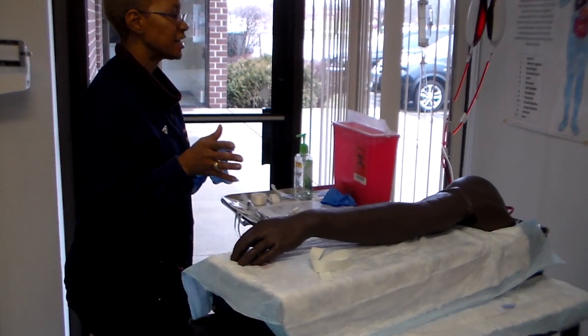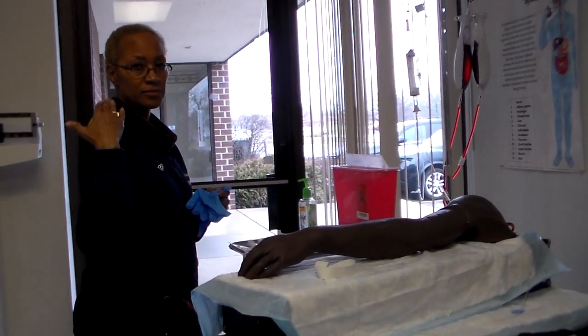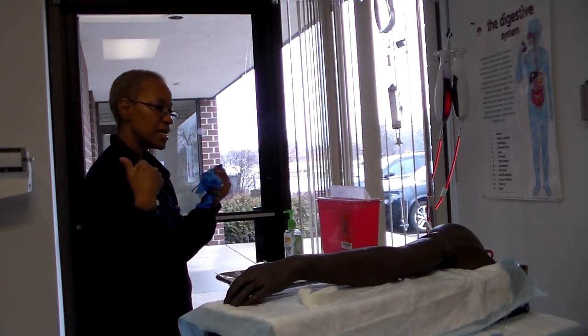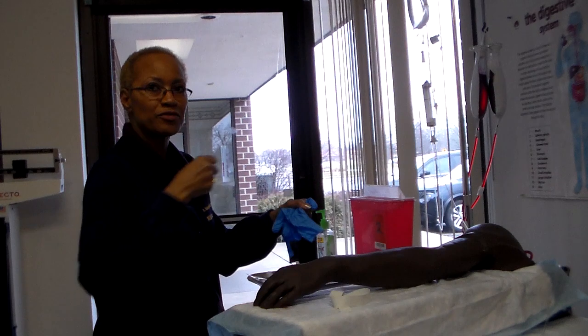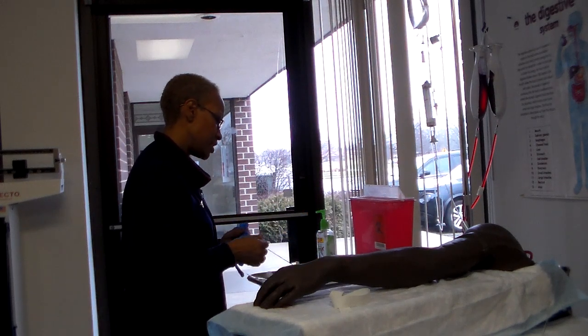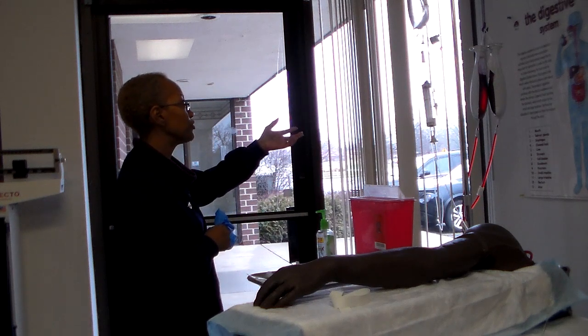You want to look at what kind of gown your client has on. If you have the snap top at the shoulder, that's good because it's easy access. You can just unsnap it. You won't have to pull the client's arm through the gown. Then we already talked about you're going to inspect your fluid.